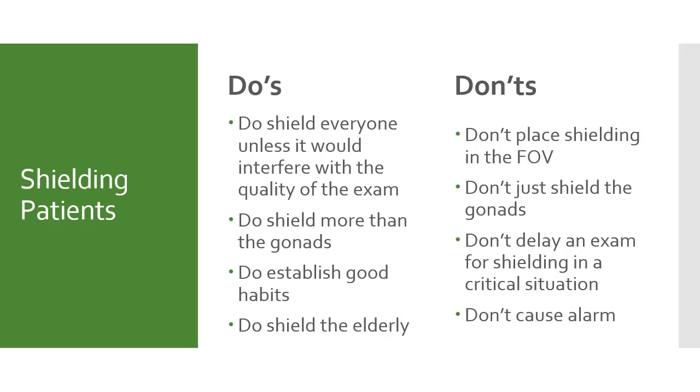Do's. You want to shield everyone unless it would interfere with the quality of the exam. You want to make sure that you shield more than just the gonads if possible. You want to establish good habits, making sure that you have that lead shield available to use whenever possible. There are many places where you'll go that you may see an older patient is not being shielded due to their age. However, again, it is HAC's policy that we shield everyone, including the elderly.